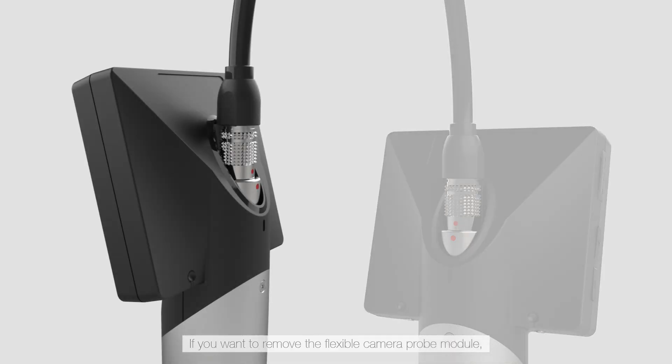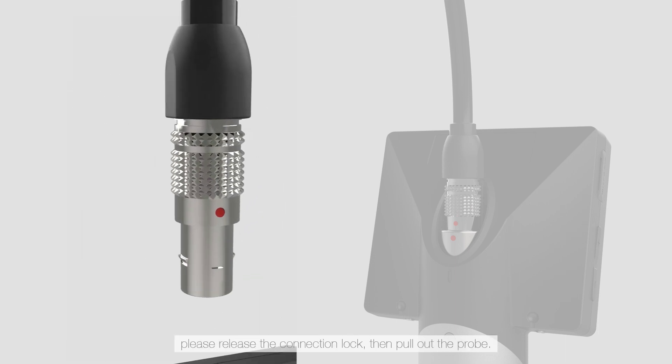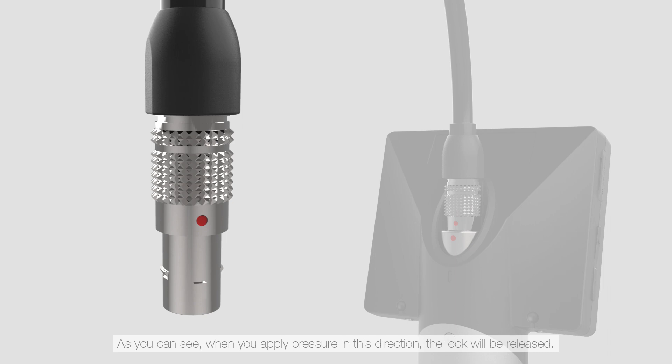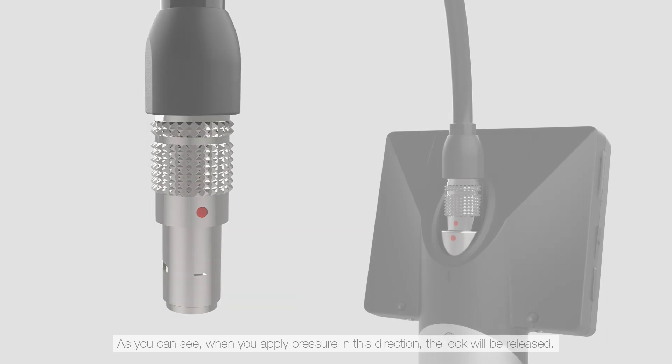If you want to remove the flexible camera probe module, please release the connection lock, then pull out the probe. As you can see, when you apply pressure in this direction, the lock will be released.